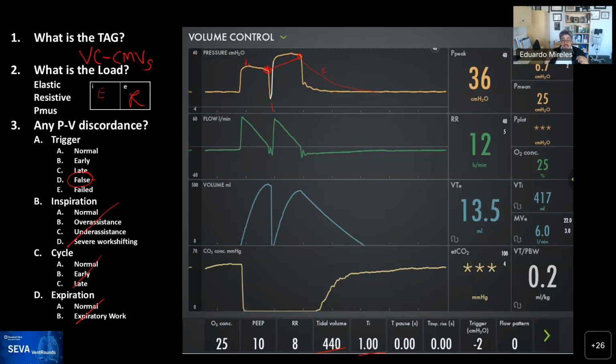And after it got dislodged, the trach was replaced, and minutes later, the patient had a cardiac arrest. Patient was resuscitated, came back, mental status is good. It was a PEA, and this is what we get.